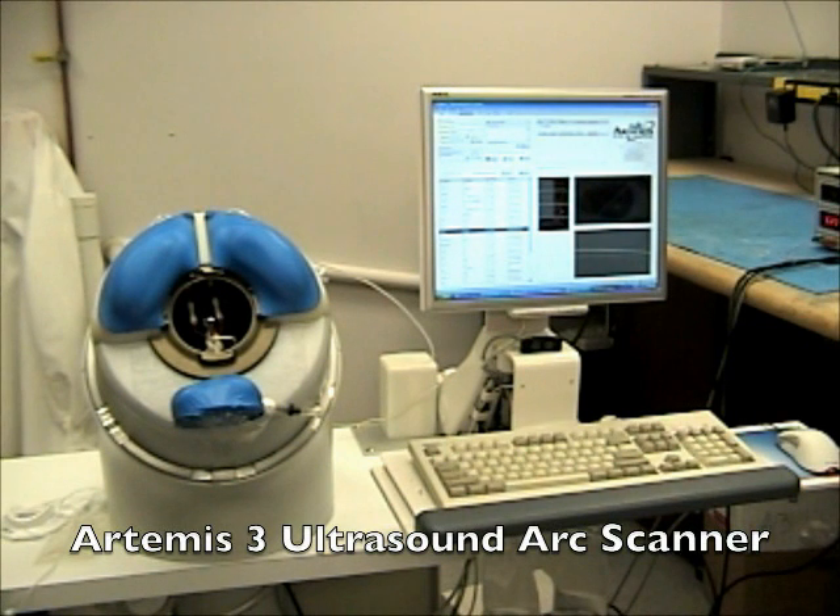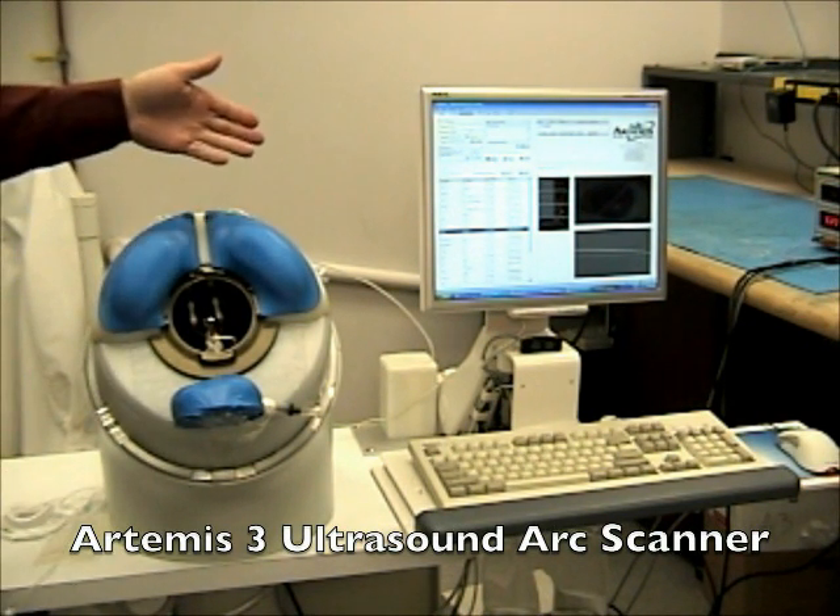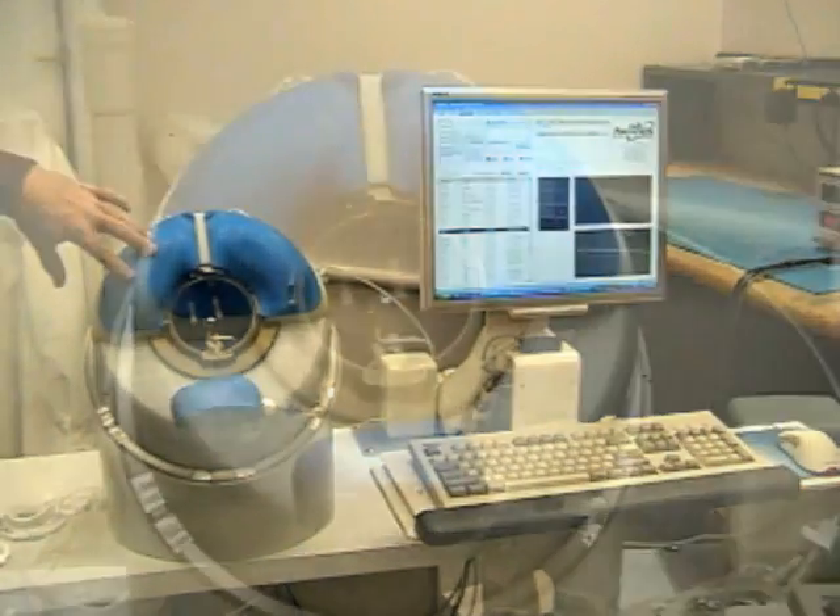This is a prototype of the Artemis III. We have the instrument, the operator station, and this is the headrest.